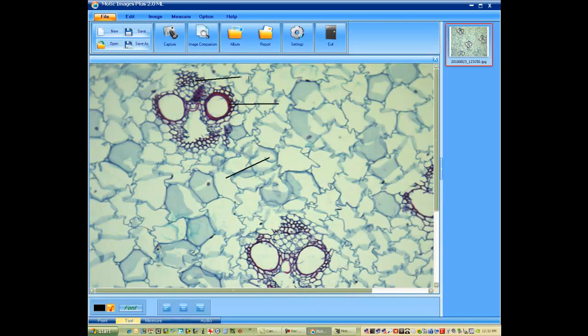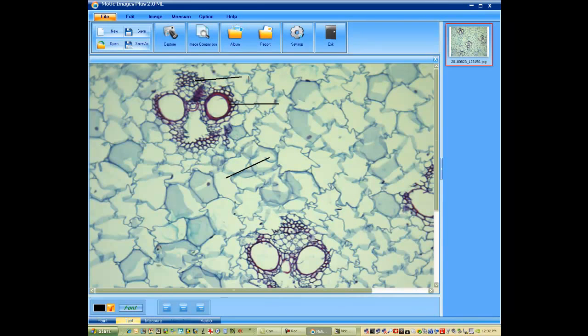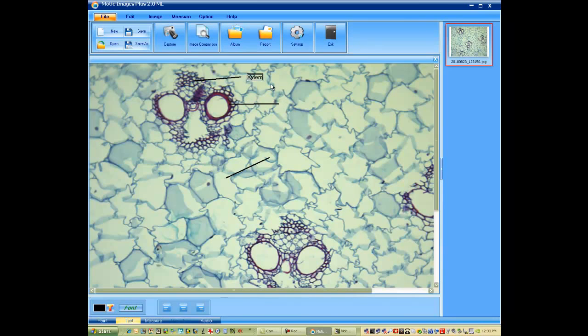In this case, these are the xylem tissue. So we'd like to activate the text tool. And once you click on it, you can move it wherever you'd like. And then to make your next selection, you need to reactivate your text tool. This is the phloem tissue.